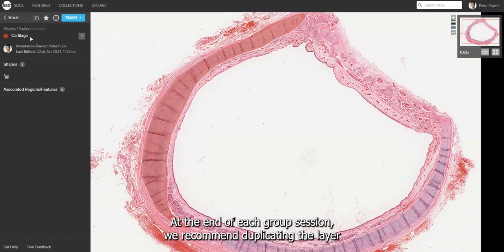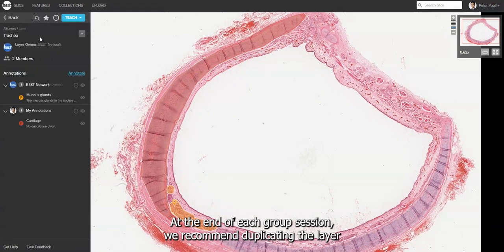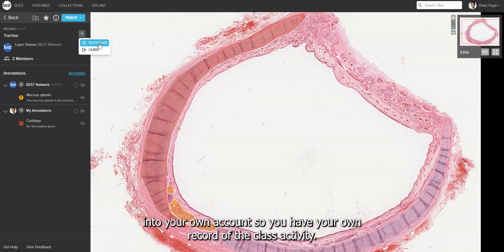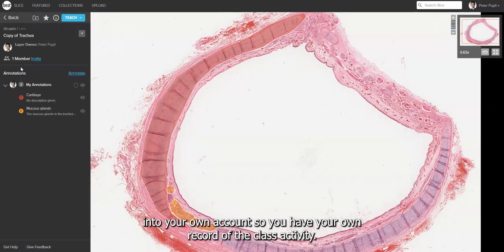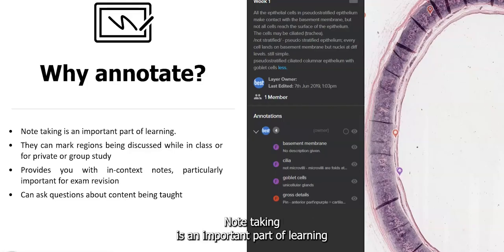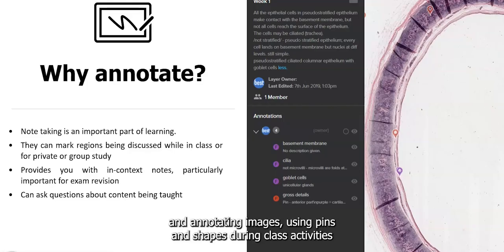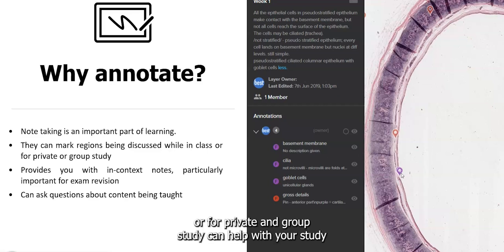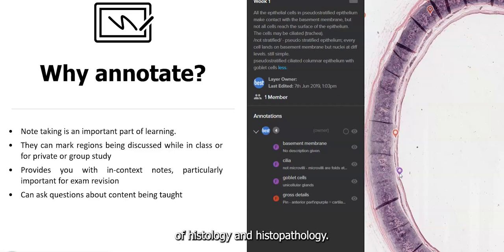At the end of each group session, we recommend duplicating the layer into your own account so you have your own record of the class activity. Note-taking is an important part of learning, and annotating images using pins and shapes during class activities or for private and group study can help with your study of histology and histopathology.